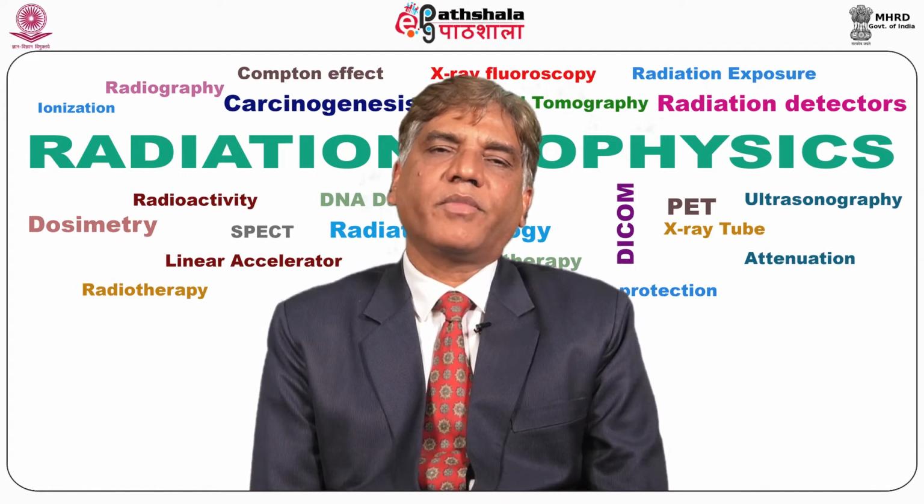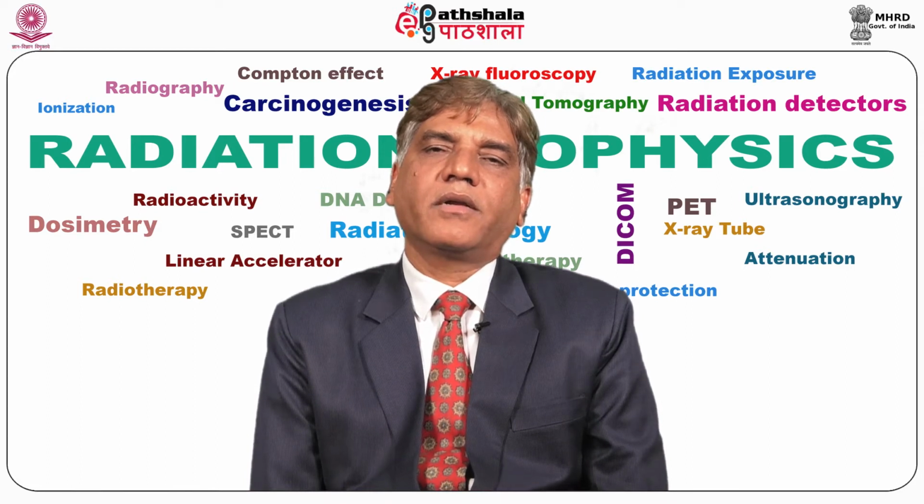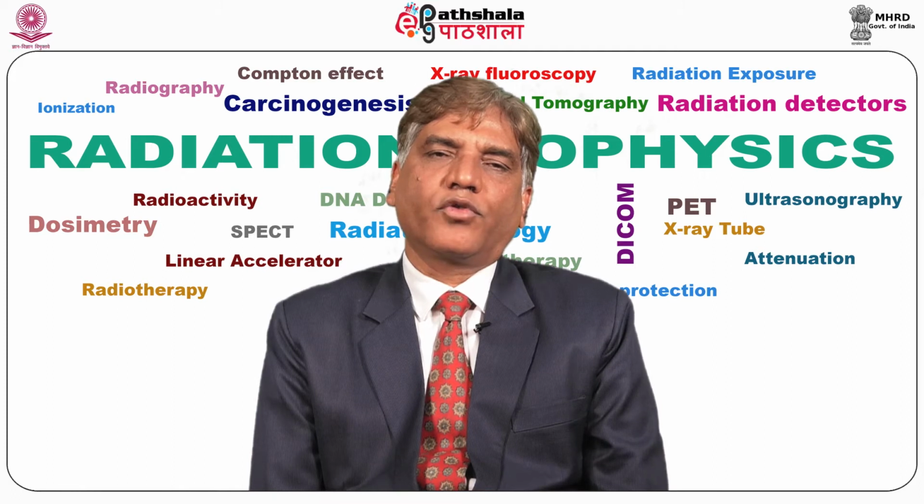During scanning, some energy is absorbed at F centers, and thus the electrons get this energy. A fraction of the electrons gain enough energy to reach the conduction band and become mobile, and then they drop back to the ground state, to the valence band, and emit light. That means trivalent europium is converted back to divalent europium. Emission of blue light is radiated, which is detected by the photomultiplier tube.